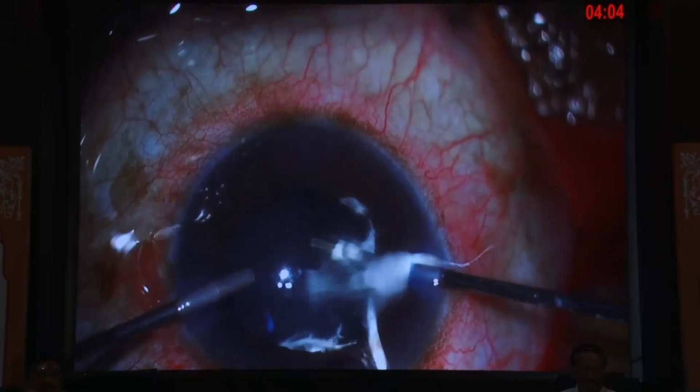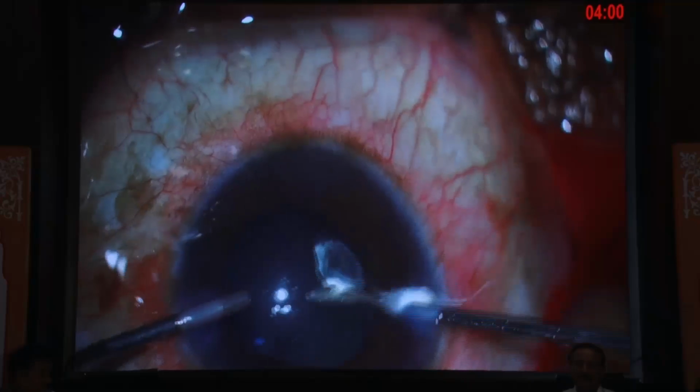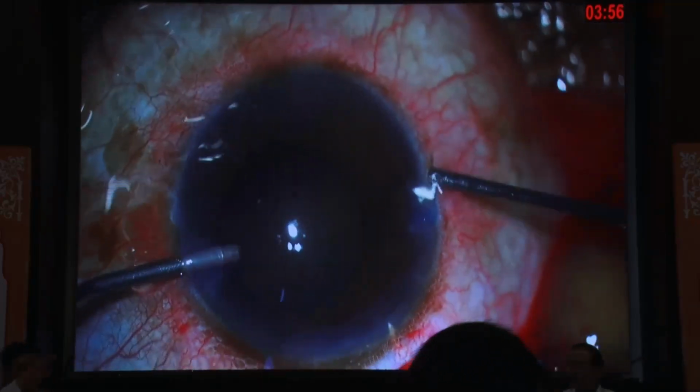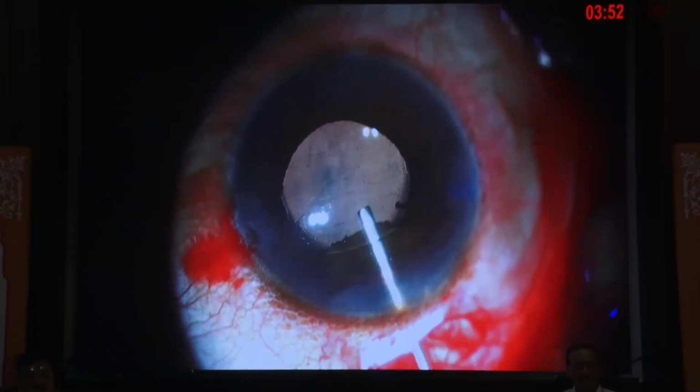You don't have to go deeper under the iris, because it is so fast. As we go near the iris, it just cuts it in a fraction of a second. So the trick here is to just stay in the center and make sure there is no vitreous in the wounds, and then you have a good result. In this particular case, we did the iris claw lenses.